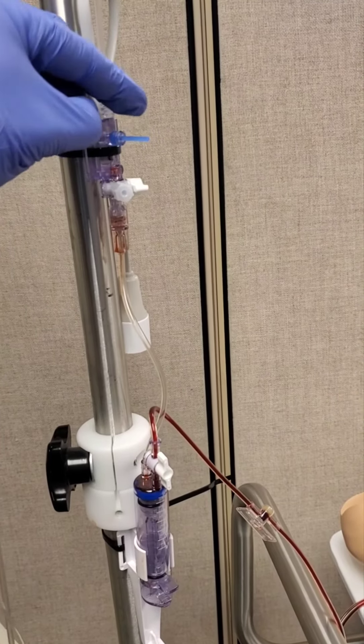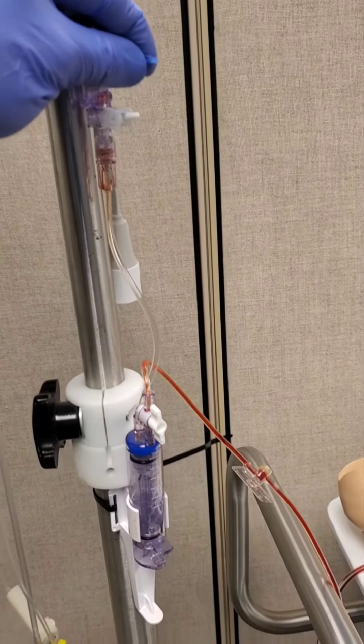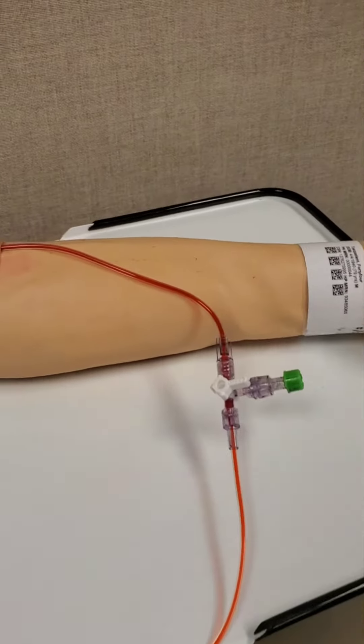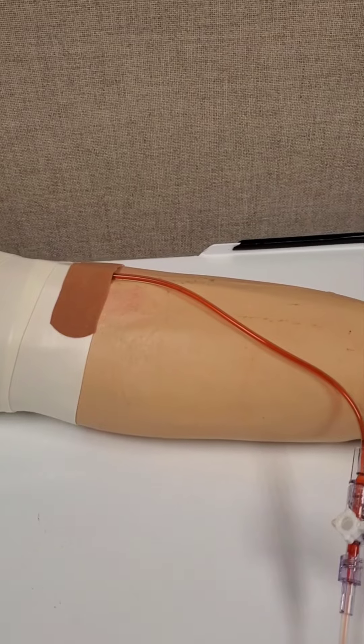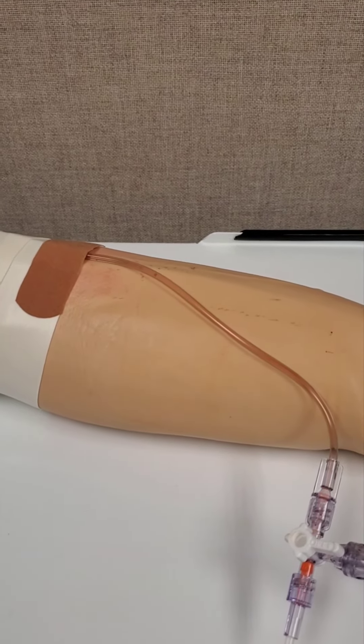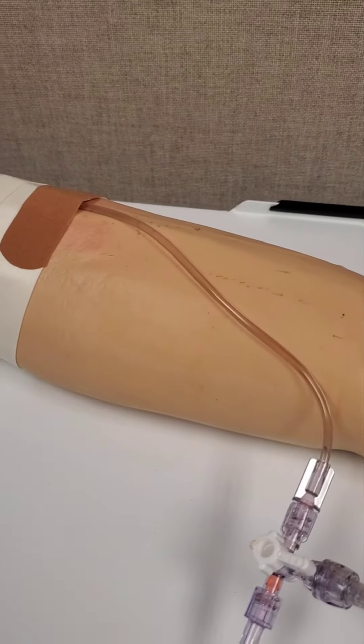At this point, grab the pigtail and allow the blood to flush through the line. Follow the line to where it enters the patient and continue pulling the pigtail until the line is clear.